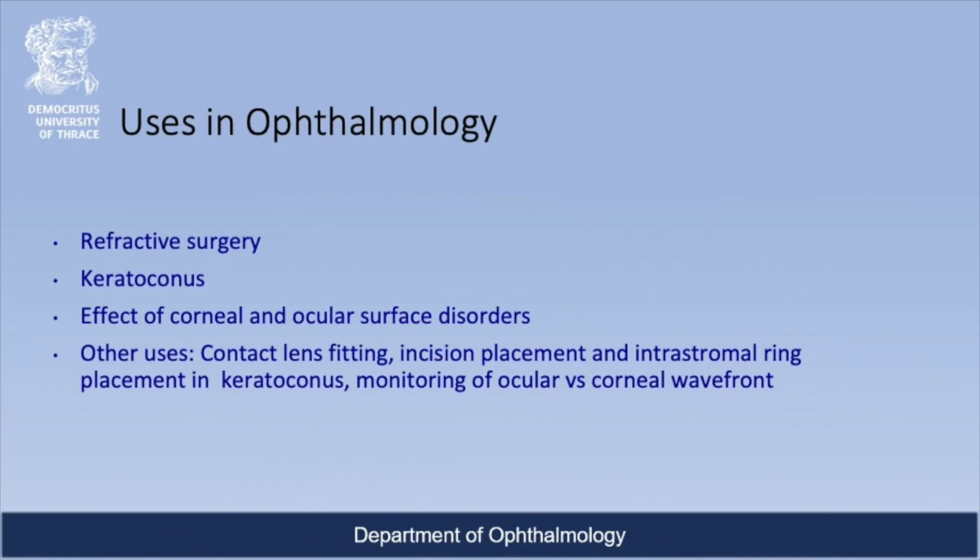It is important to summarize the applications of Placido disc topography in ophthalmology. First, one application concerns refractive surgery. Specifically, Placido disc topographers are used to screen candidates for normal corneal shape and patterns, and to rule out suspicious or keratoconic patterns. Postoperatively, topography can help to assess the dioptric change created at the corneal level, thus the effective change in the cornea, ruling out decentered or incomplete ablation, post-excimer ectasia or other changes, and it can be used in topo-guided refractive surgery.